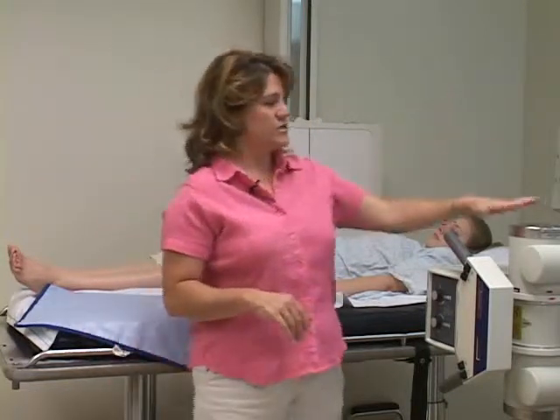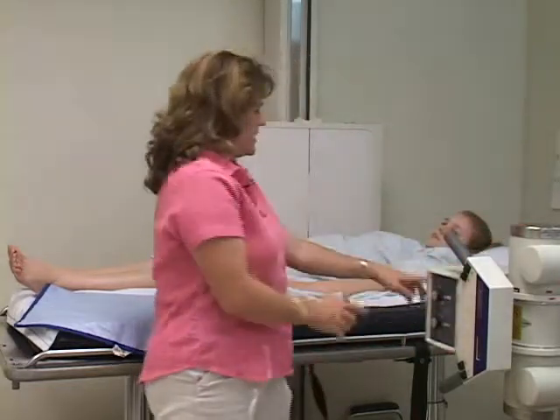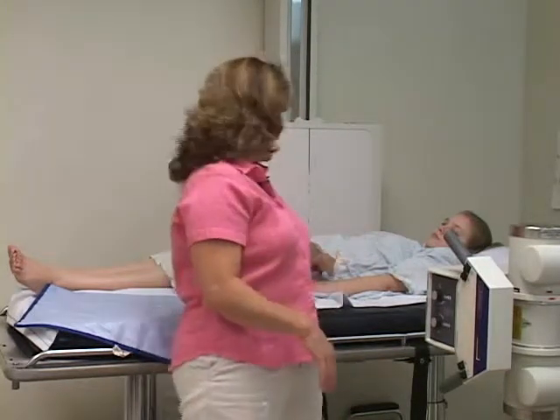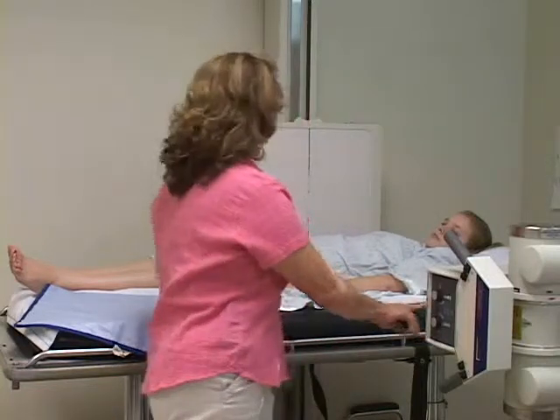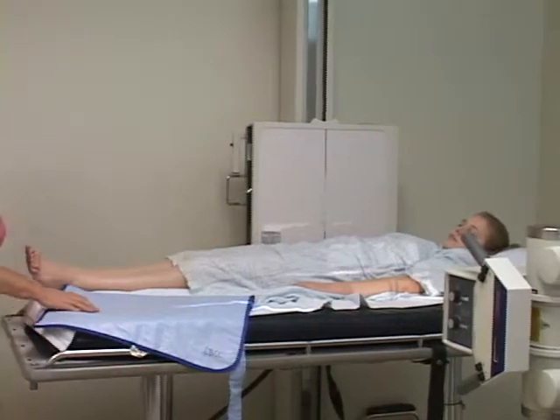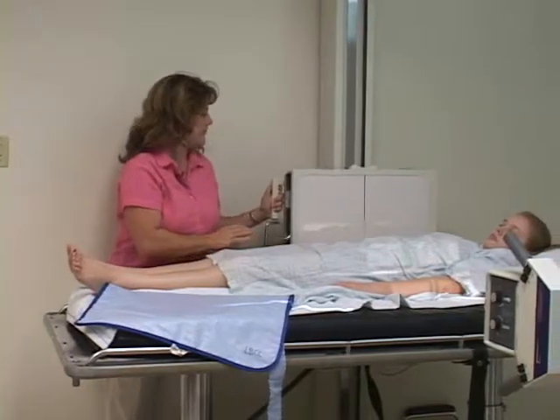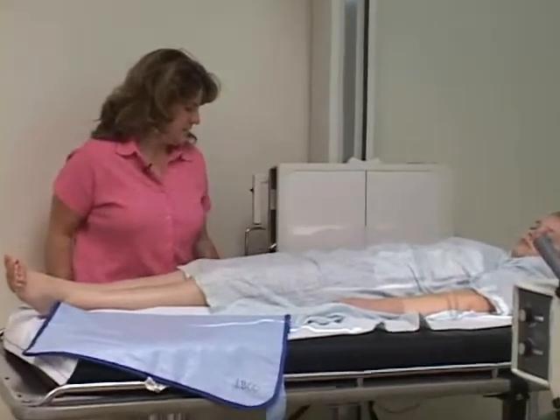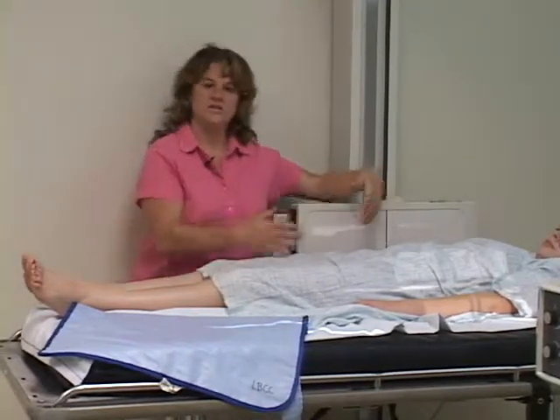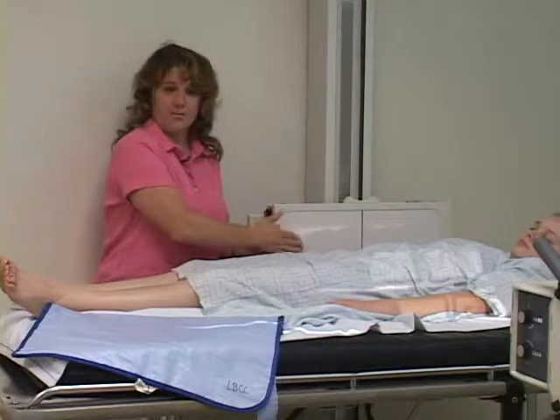So the first thing that I did is I'm at a 40-inch SID. I have moved my tube down so that my central ray is entering 2 inches above her iliac crest, and I'm entering right in the middle of her body. Okay. Checking. Okay. Then I'm going to move around, and I'm going to move my bucky so that it's lined up with my tube. Okay. And sometimes that requires moving the gurney a little bit. You want to get the patient as close to the bucky as you can because, again, you don't want a huge air gap right here.